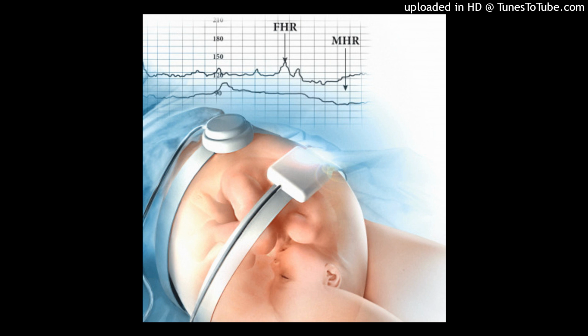In addition to the bedside, display units may be at the nursing station or other locations to allow remote surveillance when the clinician is not at the bedside. These units display the tracing on a screen and have settings for audible and visual alerts such as upper and lower limits for maternal vital signs and FHR baseline.